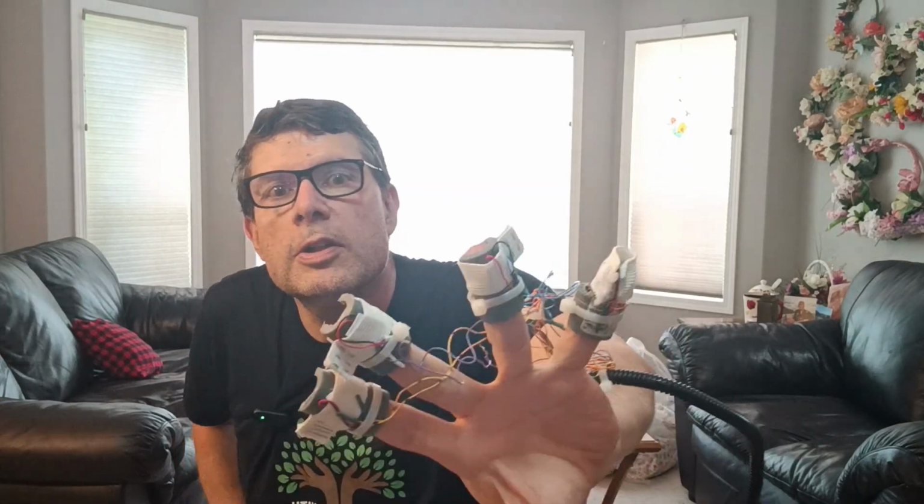And hopefully you can see on here that I've added zap straps, the little plastic ties, to hold the wires down so they don't get damaged. And I've been getting much, much better vibration contact as well. Basically, I can feel it running all the way up my arm. So this pipe, it's basically like a plastic PVC pipe. It's a 1 inch to 3/4 conversion, and we just cut off the 3/4 inch part and then trim it down till we get something that looks like this. We drill a little hole in it, and then the motor goes in there.